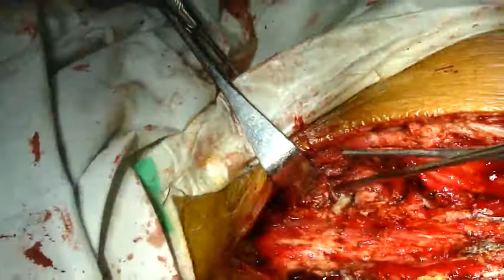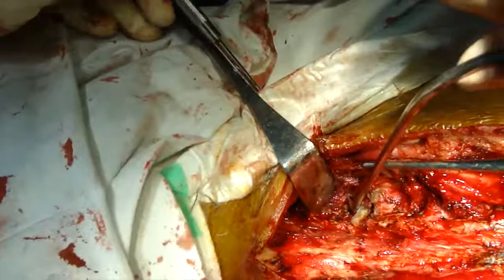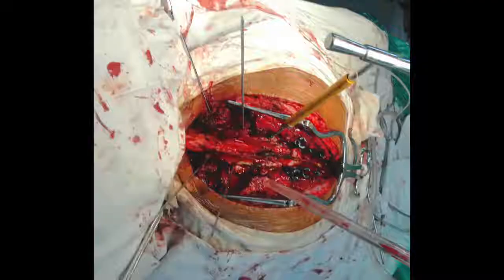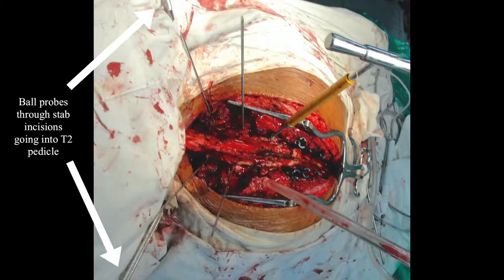Because of the high convergence angle of the T2 pedicle, a stab incision lateral to the wound was required, through which the pedicle finder was passed. Here, one can see the ball probe feeler used to palpate the pedicle walls through this stab incision. This is a view from the top where one can appreciate the high convergence angle of the T2 pedicle screw trajectory.